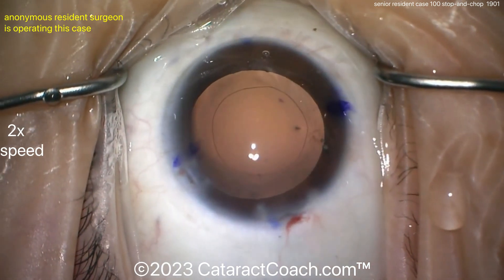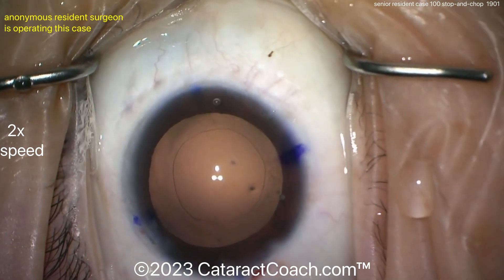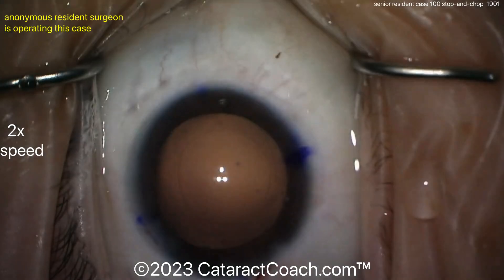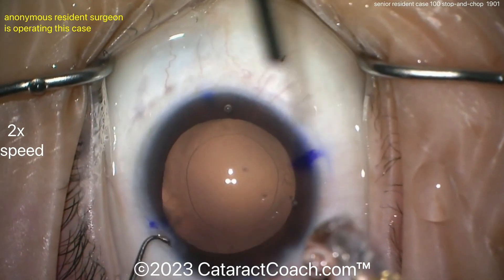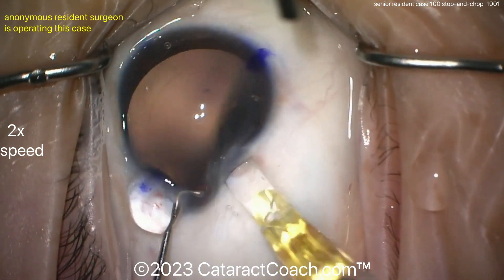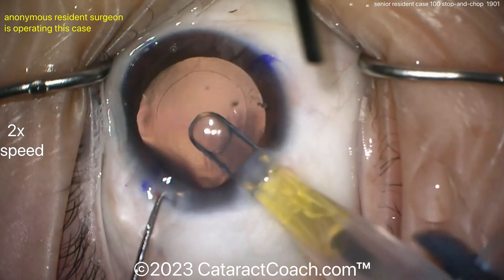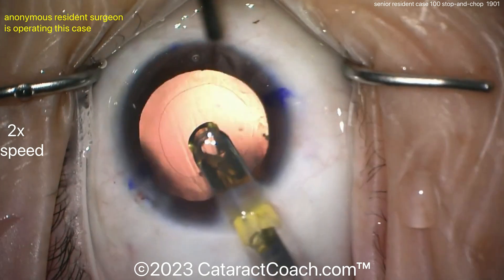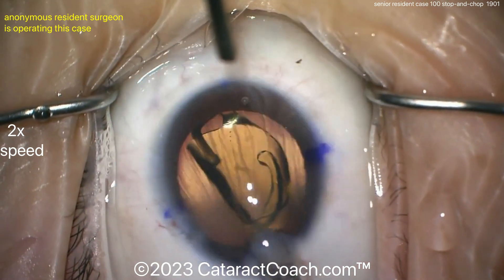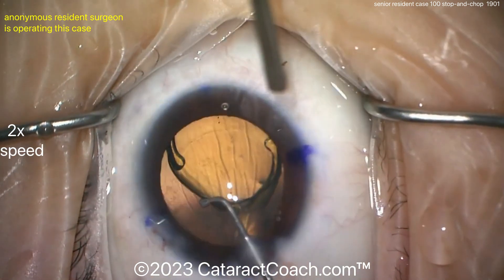The young doctor is loading up the lens and placing it inside the eye — let's see what we got. Beautifully done case. My only criticism so far is basically I didn't like the incision that much. There's a little bit of a tight fit — not sure why, it was a 2.75 keratome. You don't need to have the injector tip that far inside the eye when delivering the lens. There it is — I did like the rhexis, and I certainly like the nucleus division technique.